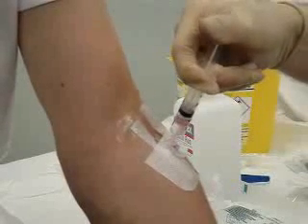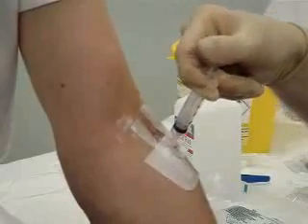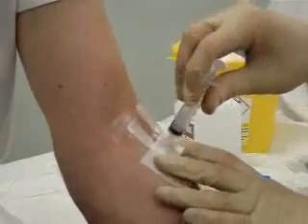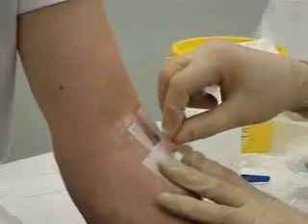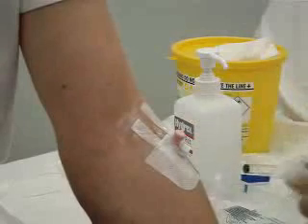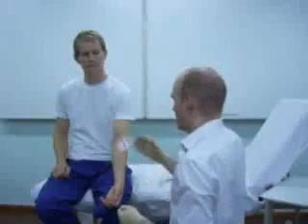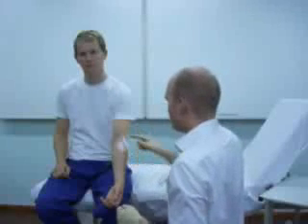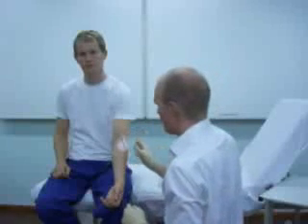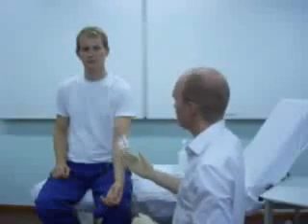Can you feel anything there, Ben? A little bit, yeah. Again, patients sometimes feel a sensation of cold travelling up the arm because of the cold sodium chloride that goes up through the arm. Okay, so that's the cannula inserted now. You can give the patient some advice. You can see that the insertion point is quite clearly labelled, and then the procedure's finished. Thank you, Ben.